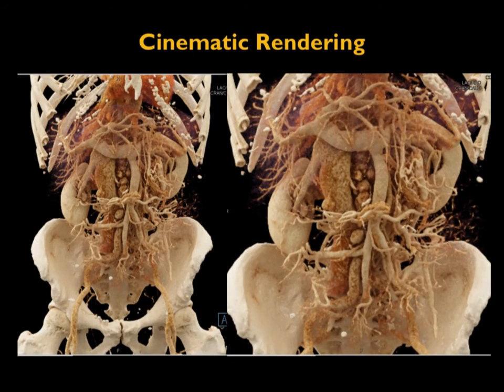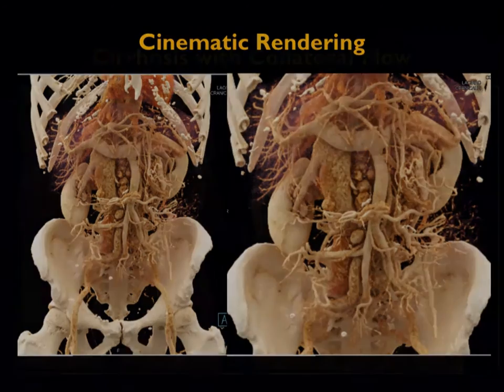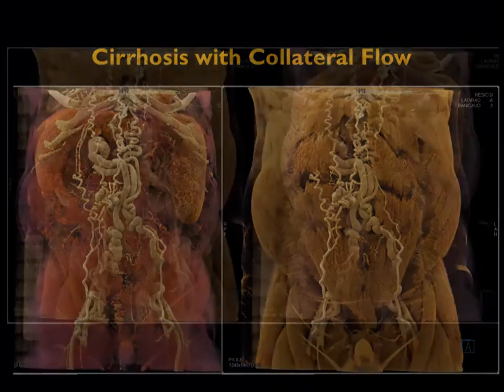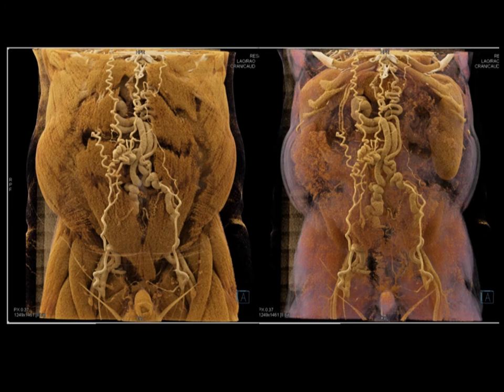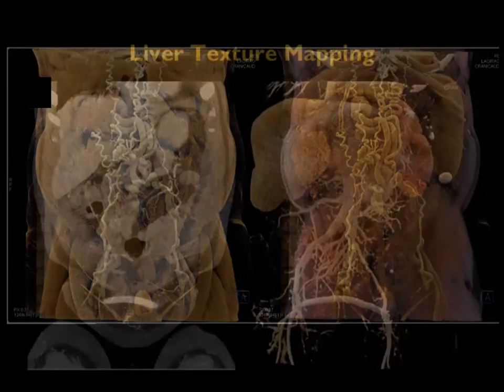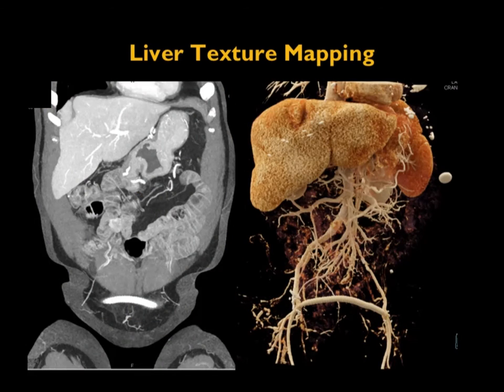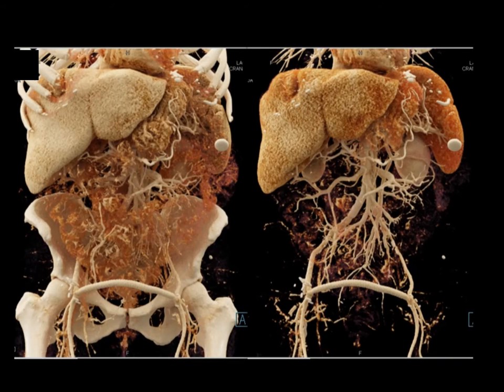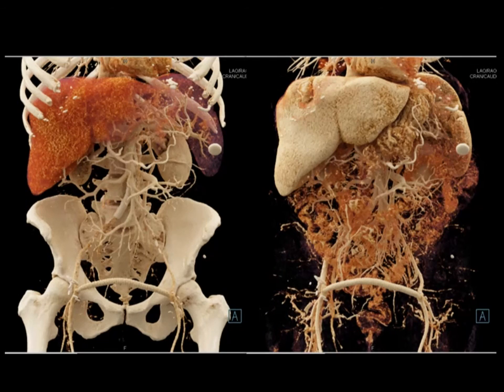Here is a patient with a neuroendocrine tumor — a neurogenic tumor with extensive adenopathy which is vascular — and there is the 3D map impressively showing the vessels and their relationship to the nodes. In a patient with cirrhosis with recanalization of the umbilical vein, look at those collaterals and the relationship of the vessels to the abdominal wall, changing the lighting models to accentuate that.